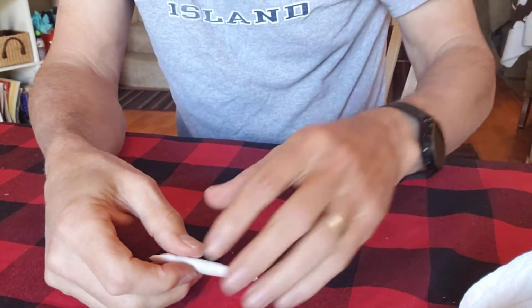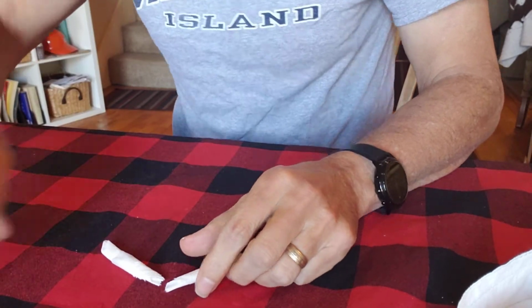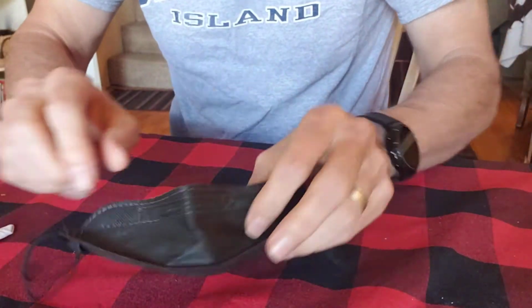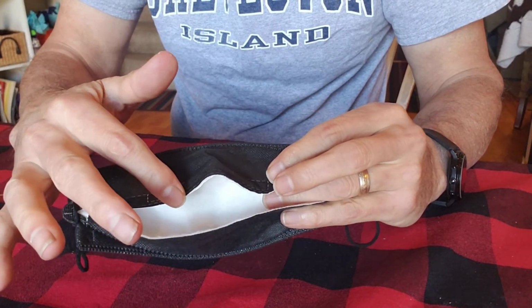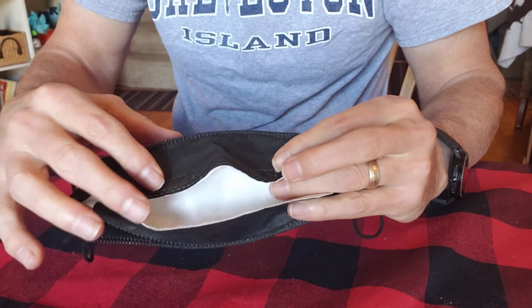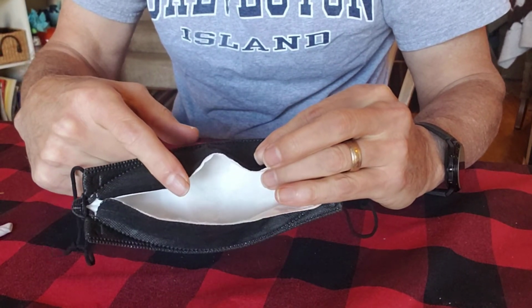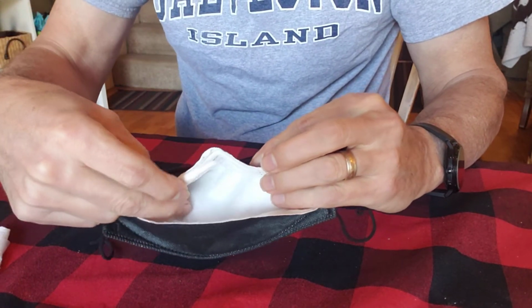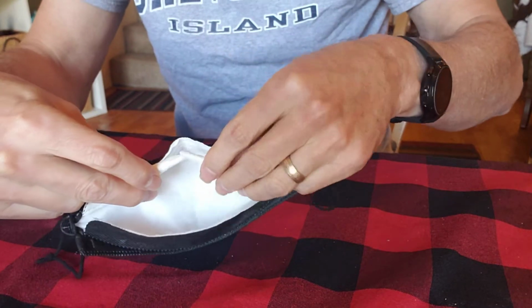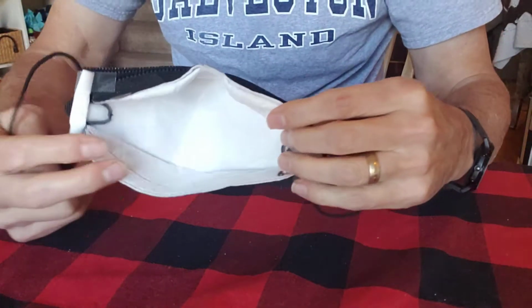And so I get 2 of those, and I'll place them inside of a mask. The place that I would aim to place them is so that the thickest part is right where my nose would reach my face. And here I have a pre-bent mask, and this pocket right there is where I want the thickest part to go. So I'll tape one in there, one in there, and when I'm all done, it'll look something like this.